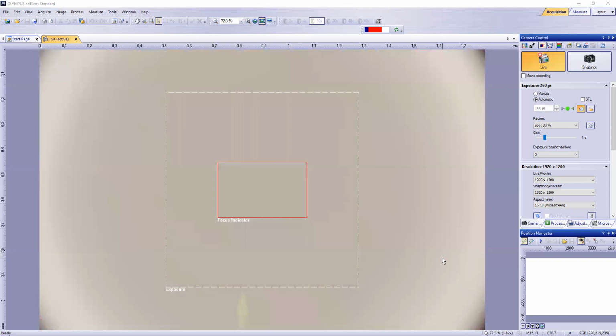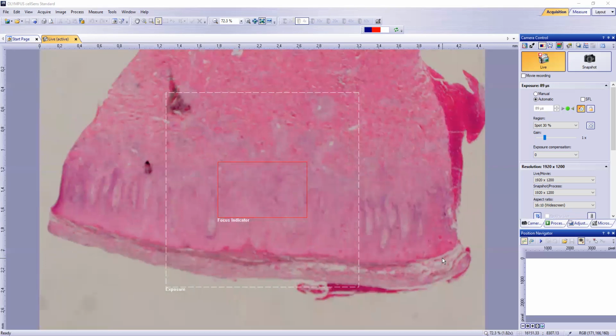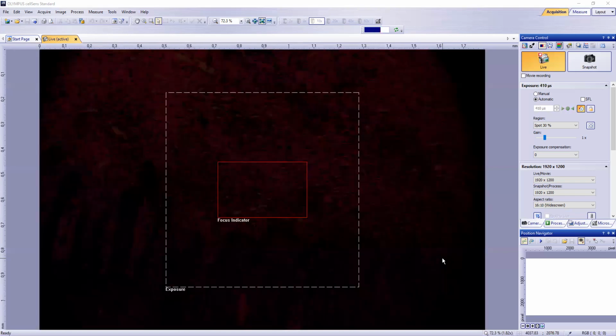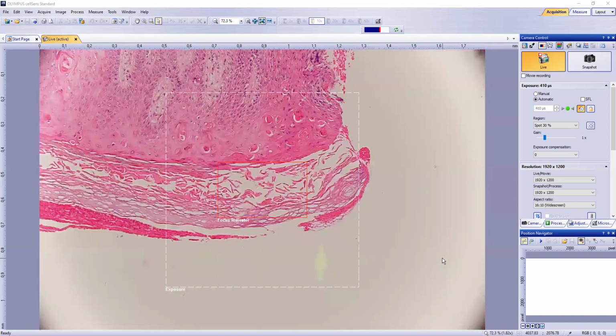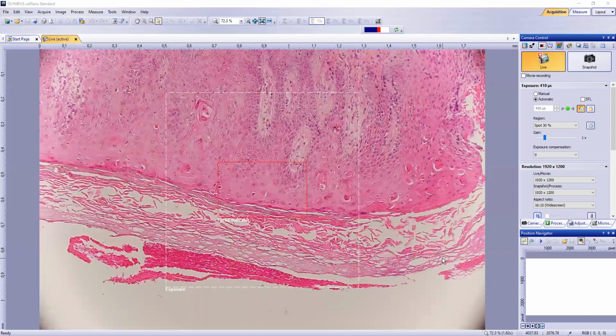The next set of entities we'll discuss is the distinction between erythema multiforme and PLEVA. So erythema multiforme tends to have what we call an acute stratum corneum. So when you look at the stratum corneum, you'll notice that the basket weave pattern is retained because this is an acute process. So you, in large part, have retention of the basket weave stratum corneum, and you may have mild parakeratosis that develops in later stage lesions.